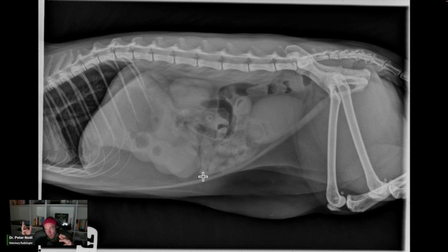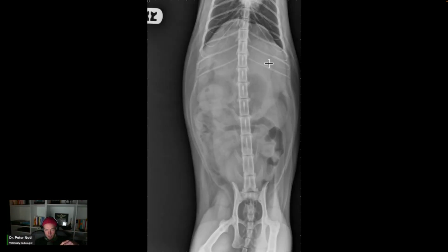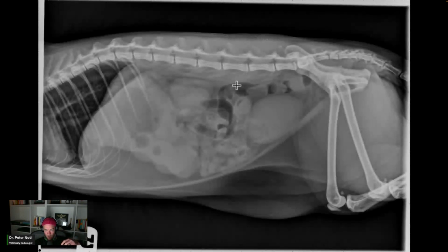Annular carcinoma, I'm going on these tangents. The annular carcinoma tends to cause chronic partials, and so you tend to have less peristalsis. It just kind of goes, so big old bag of fluid, big old stomach. This is all stomach. This whole thing is stomach. And this is a gas cap sitting on a bunch of fluid. So when you see a stomach like that full of fluid, you think proximal obstruction. Where's the proximal obstruction? Because all the fluid is dumping upstream into the stomach.